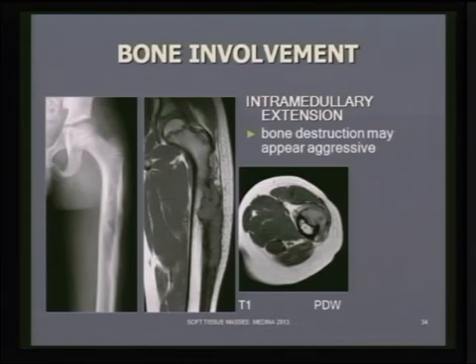Again, intramedullary extension does not necessarily imply malignant disease. This is another case of fibromatosis, this time in the thigh. I think it's very unusual in my experience for fibromatosis to cause bone erosion. The appearances can sometimes be quite aggressive, as you see on the plain film here. Very poorly defined lytic lesion within bone. We can't identify a sclerotic margin as we saw in the other cases, but the MRI study demonstrates a mainly extraskeletal lobular mass with secondary erosion of the bony cortex. And no actual medullary invasion, but invasion of the endosteal cortex here.